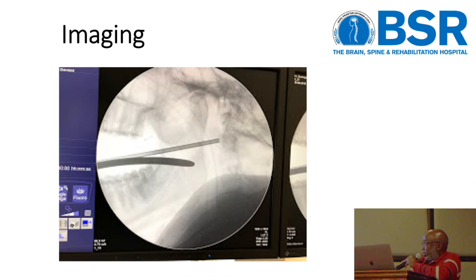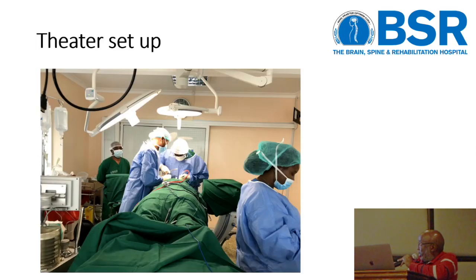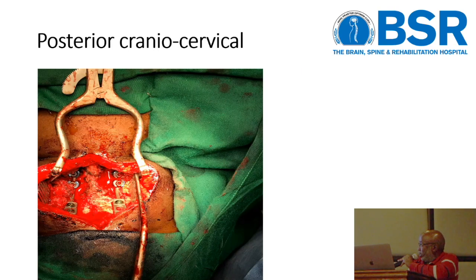You use a pointer. You can use the C-arm to get your radiological mappings, and that's our theater setup where we operate from.